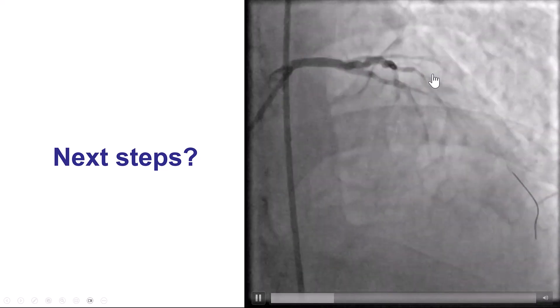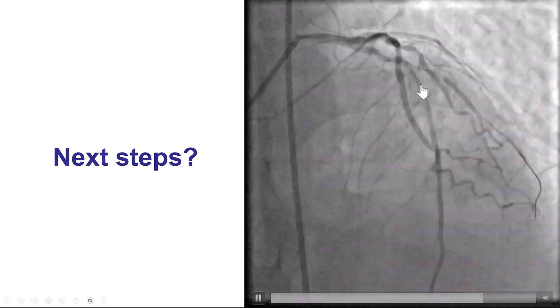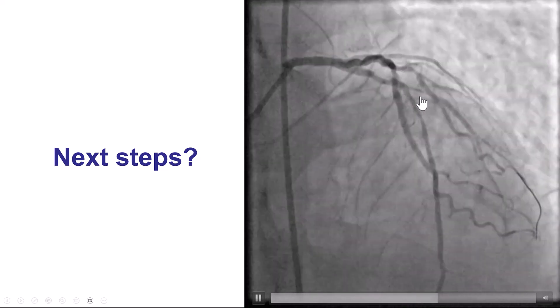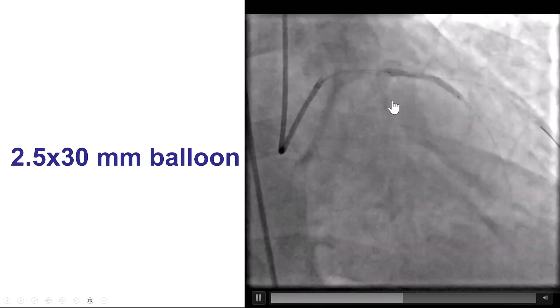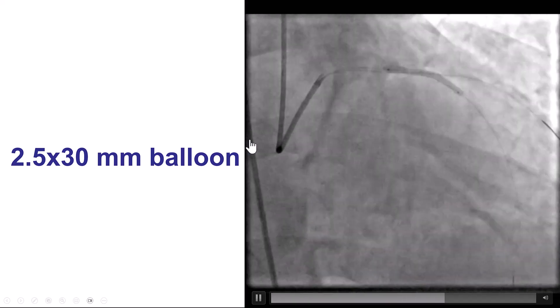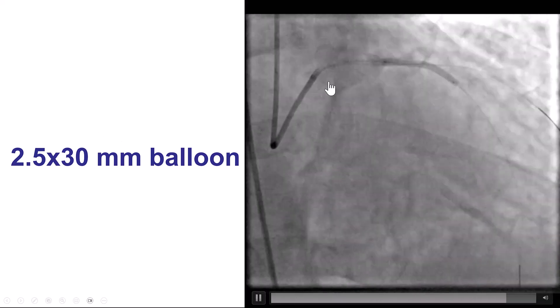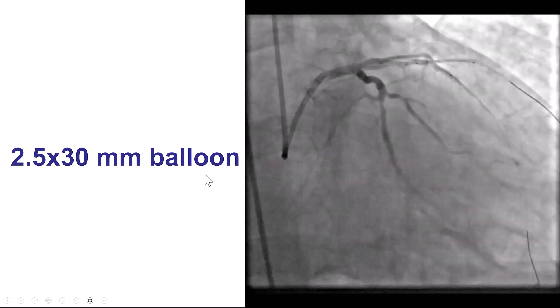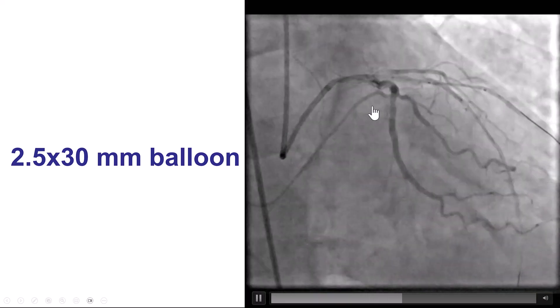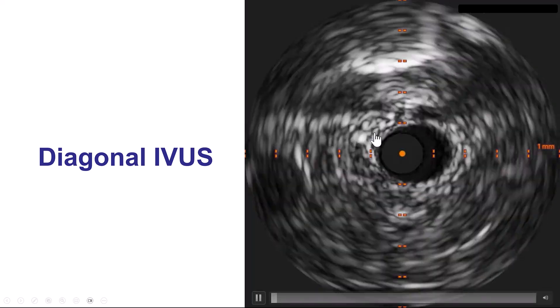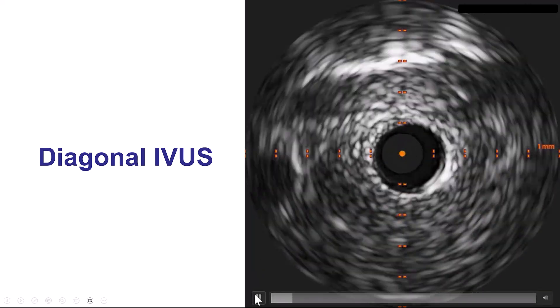So we decided to use a two-stent strategy, although those strategies can be more time-consuming compared to provisional stenting. We ballooned both vessels with a 2.5-millimeter balloon that seemed to expand well, and then delivered a stent in the diagonal after doing an intravascular ultrasound.